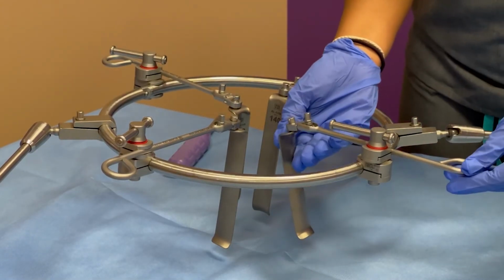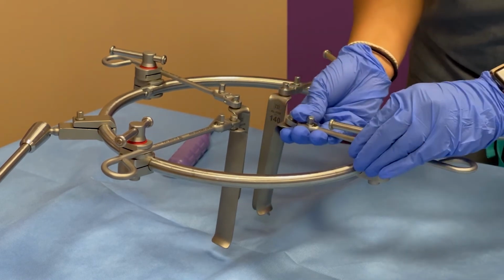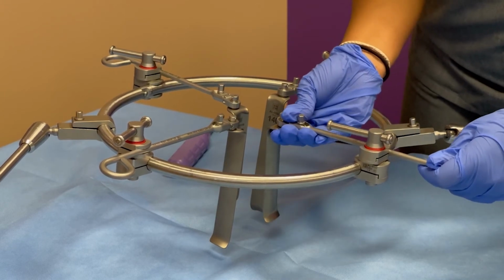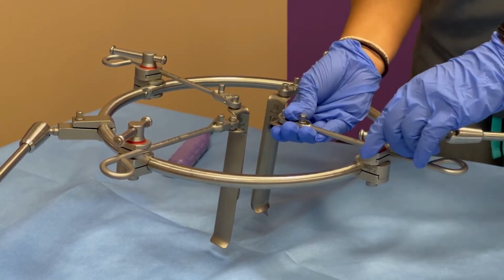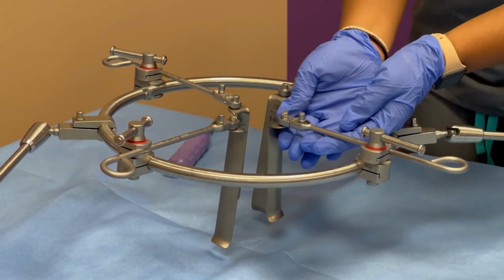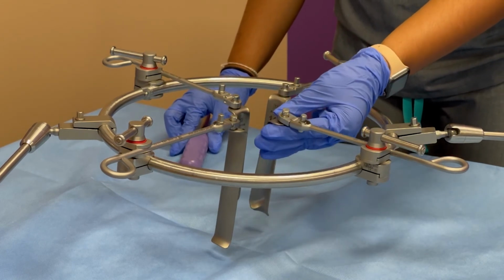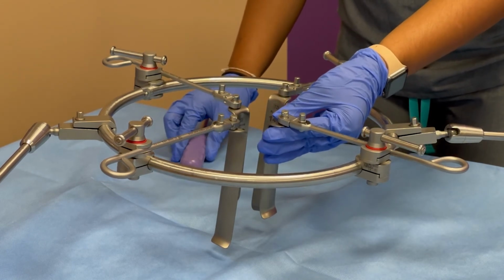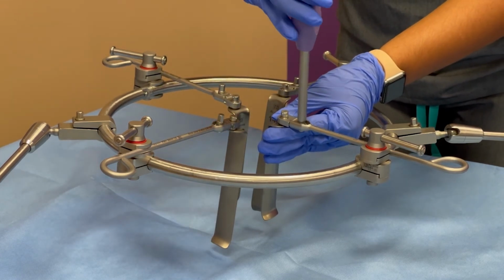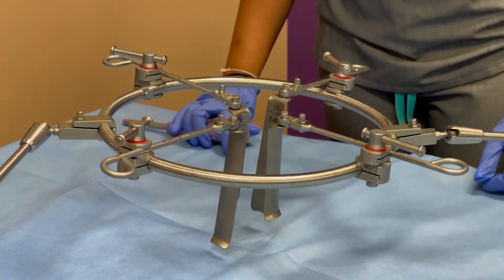Once you have attached your blade holder and blade assembly to the ring clamps, you'll notice that it is freely movable within the ring clamp itself. Once you have it exactly where it needs to be, you'll tighten down on the ring clamp, which will fix it into place. The next feature on the blade holder is the pivoting mechanism, which you can see and work here. Once you have the blade exactly where you would like it in the incision, you'll use our AL hex wrench to tighten the pivoting feature on the blade holder and secure it in place.